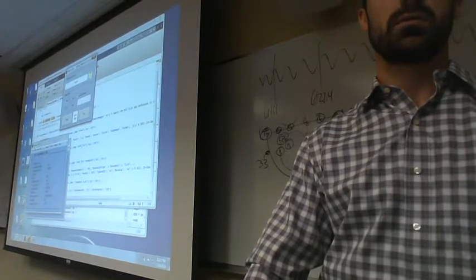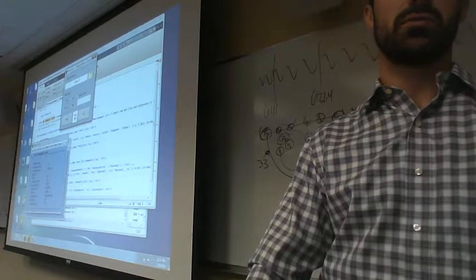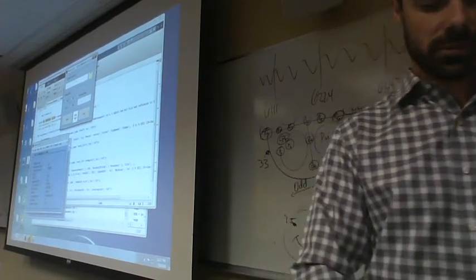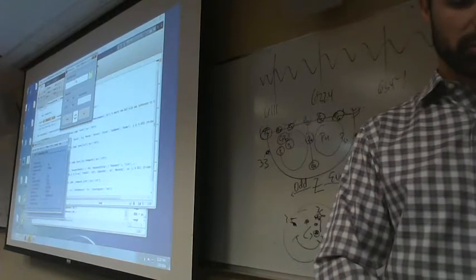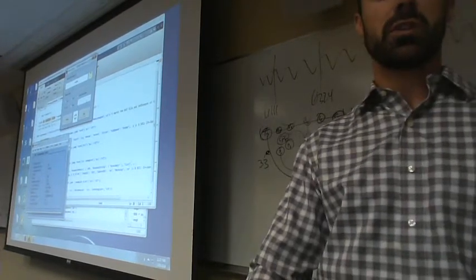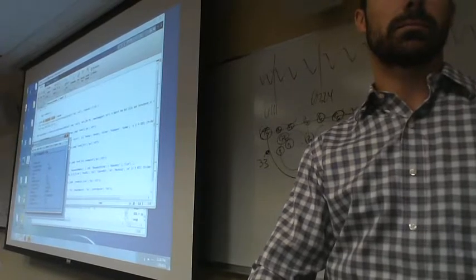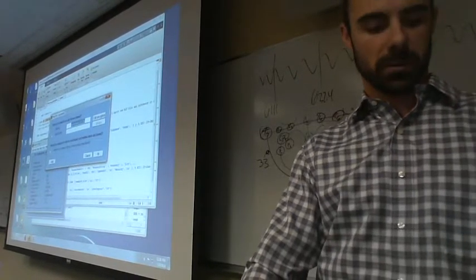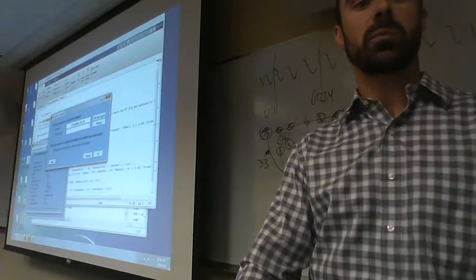Okay, so here we'll keep it, let's say, to, I don't know, let's do -500 to 1500, and you just hit run. And it adds BE to our suffix, so that's bin epoch. We copy that and we save it just like we've been practicing.